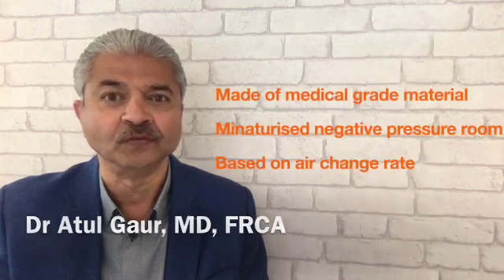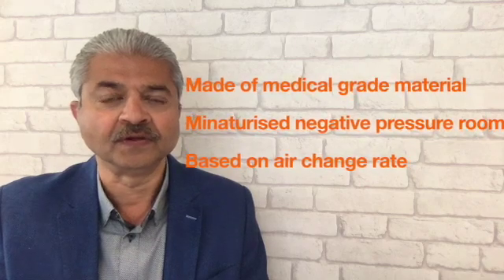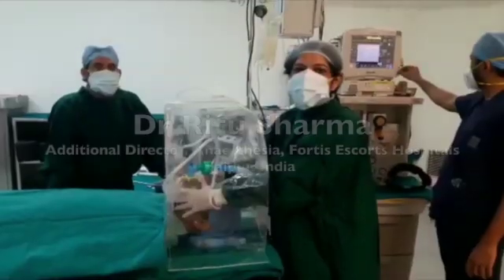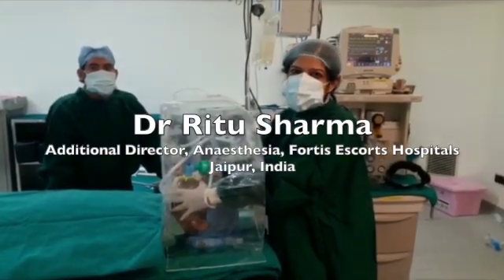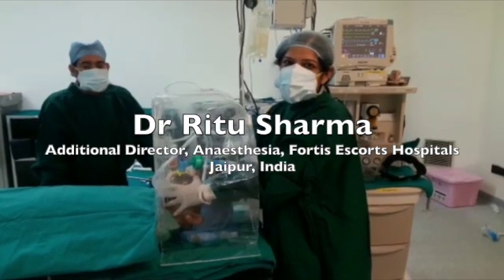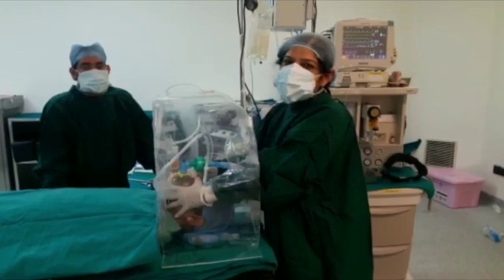Infection control assist device, or iCAD, is a miniaturized negative pressure room. It is based on the principles of air change rate. We have been using the iCAD prototype device for almost 4 months and found it to be very useful in COVID suspect patients in this era of COVID infection.